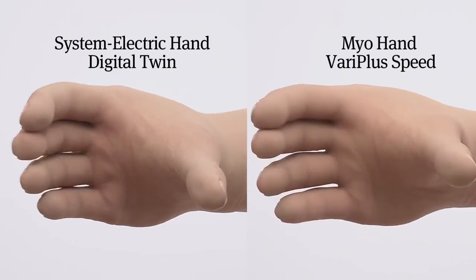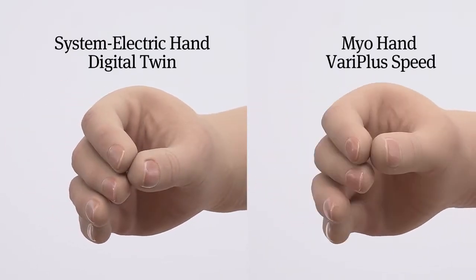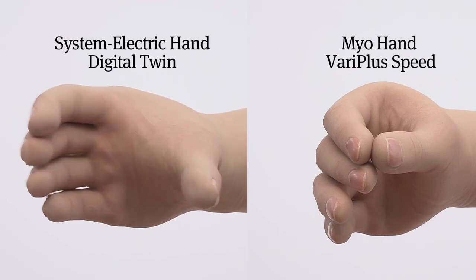The VariPlus Speed hand opens and closes more than twice as fast as other electric hands.